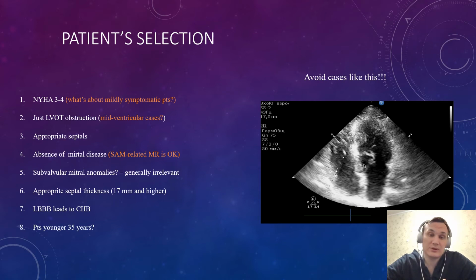And if we observe SAM-related MR, I mean systolic anterior motion related mitral regurgitation, generally it's okay, because after septal reduction, the systolic anterior motion is decreasing, and as well mitral regurgitation might be reduced by maybe more than 60%, I believe.